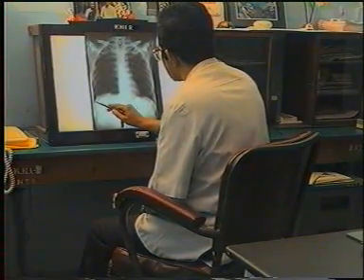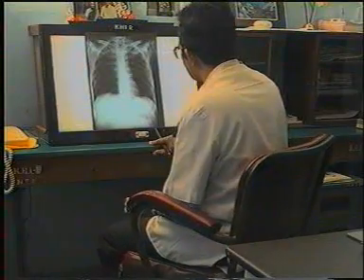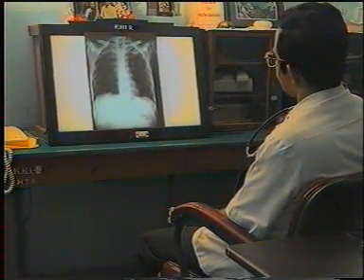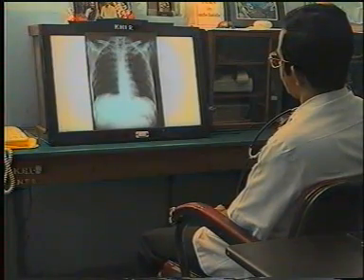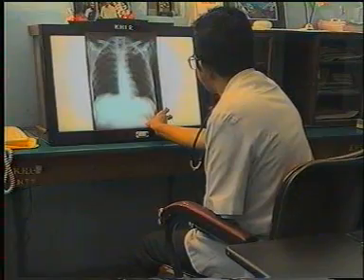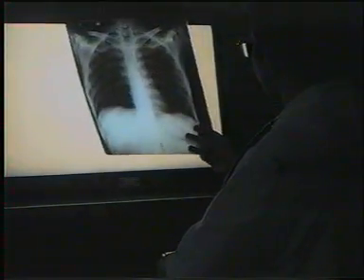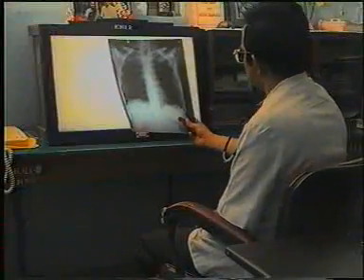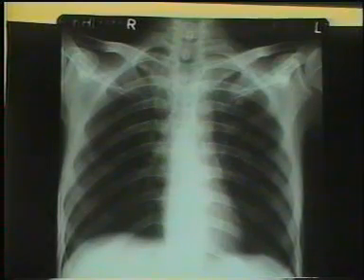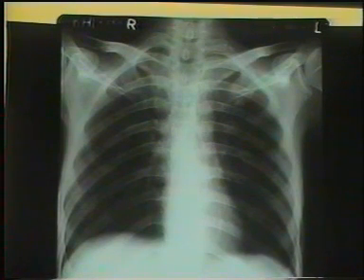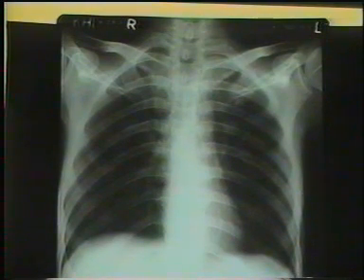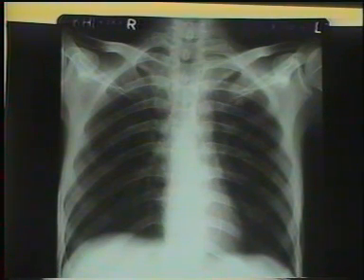After studying all these minute details, it is very important to stand at a distance and look at the film as a whole, because many times a close and minute inspection may miss a gross change. Then hold the film at an angle and view it slightly tangentially. Minor changes in radiolucency of the lungs are better appreciated this way. This completes the study of an x-ray of the chest. Over the years, with experience, you become so familiar with the normal structures that a change will be recognized at a glance. But a good practitioner will never call an x-ray as normal at a glance. Even the most experienced radiologist will study the film systematically and minutely before giving his opinion.